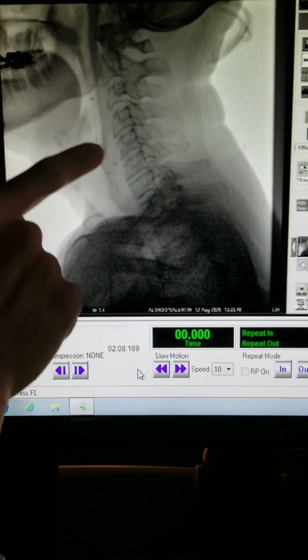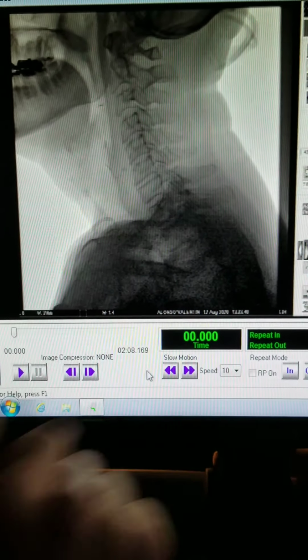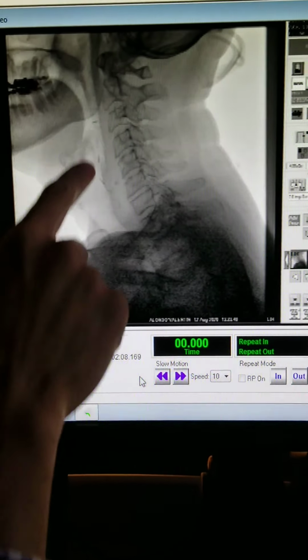As long as the food and the liquid stay along the back of the throat, which is right about here, it's going to enter the esophagus and then make its way down into the stomach. So I want to make sure nothing goes towards the front. That's the wrong pipe. The expression going down the wrong pipe, that would be the wrong pipe.